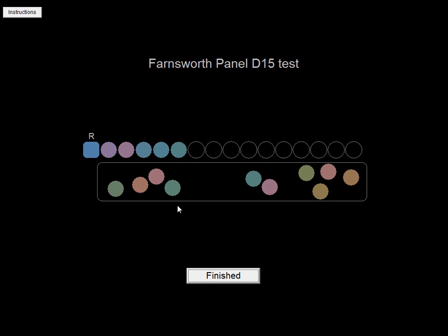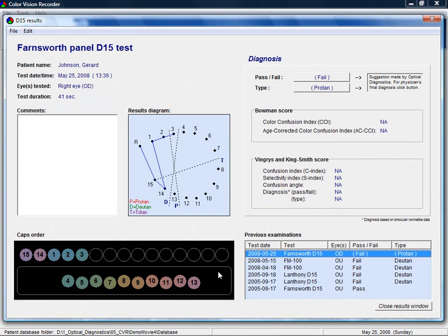After all colors are ordered, click the finished button and the results of the test will be shown.